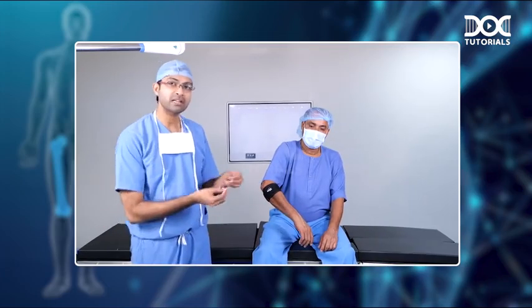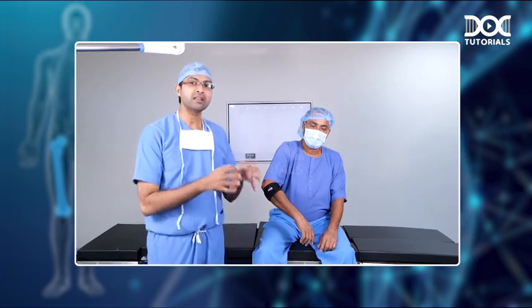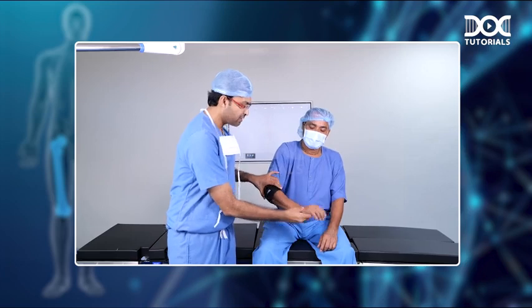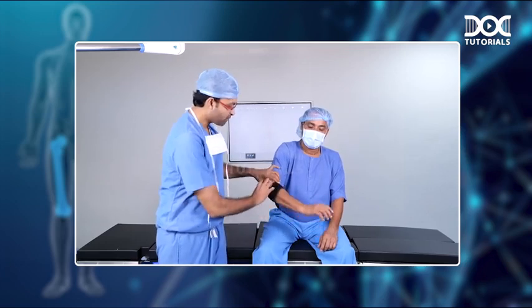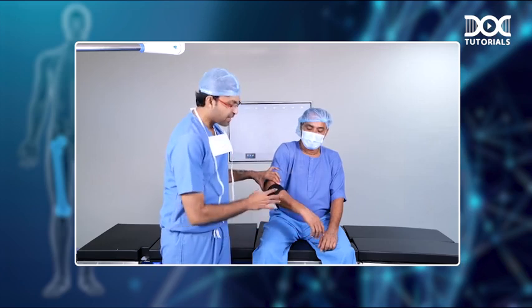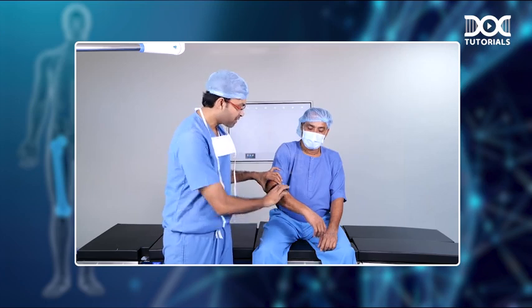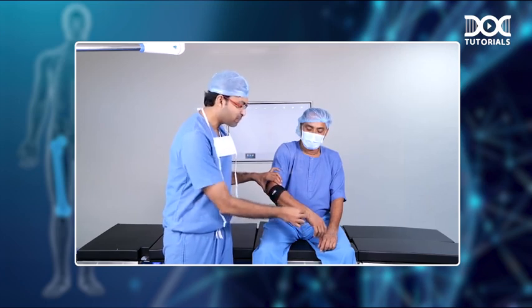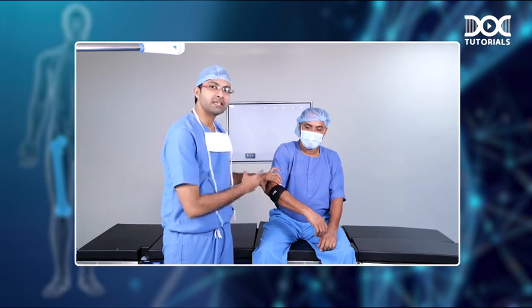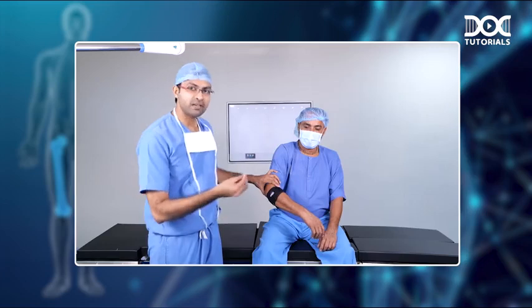Now what is the idea behind putting the brace like this? See, the primary problem in tennis elbow is an overactivity of wrist extension, and this will cause inflammation of the common wrist extensor origins. So the idea here is that whenever the patient is doing daily activities, this counterforce brace will prevent the transmission of the effort to the lateral epicondyle. So basically this device offloads the lateral epicondyle, causing pain relief.